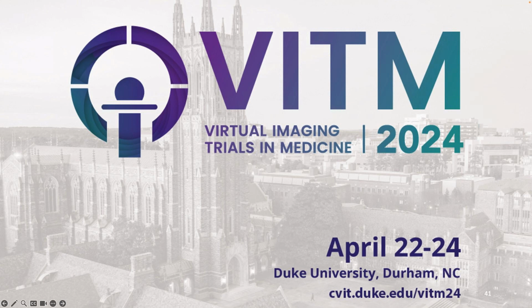Like when you do CT simulations, you're modeling the source. The source is a continuous area. There's a focal spot area. In reality, you want to shoot your photons from that area. But computationally, that's not feasible. That would be a huge computation if you want to model that. So what we do is we sample the area, but then we are uncertain whether that sampled version would create a reality or not.